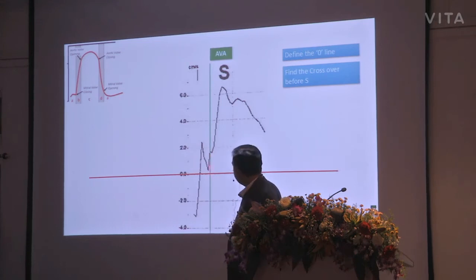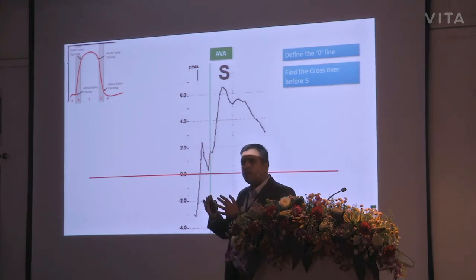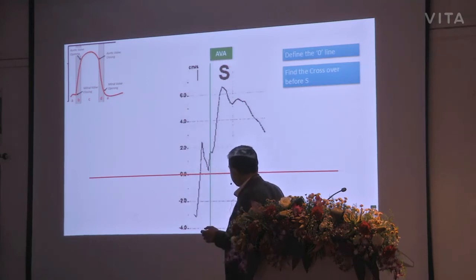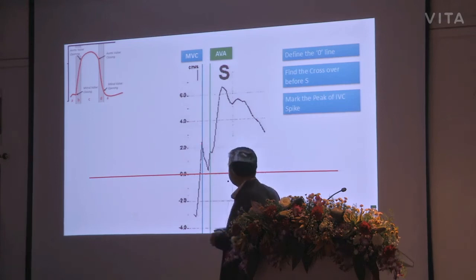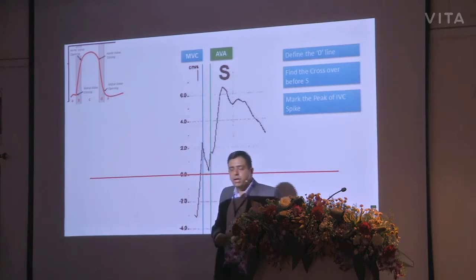Okay. This isovolumic spike, as we call it, a lot of people wondered what it was, and they thought, well, the spike must be the mitral valve closure is causing this spike velocity. It is, but with a caveat. The mitral valve closure happens at the peak of the spike and not at the base of the spike. Okay. And how do we know this?